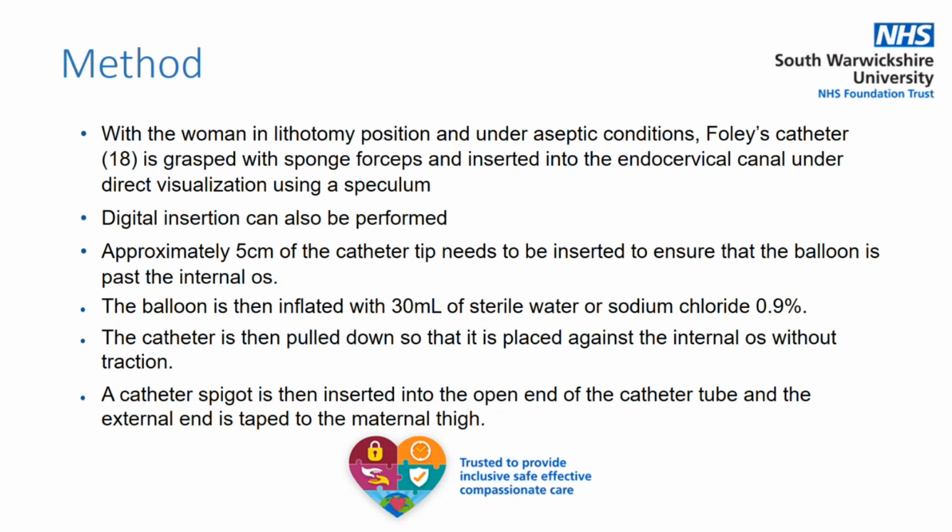So moving on now to talk about the methods for insertion of the Foley's. I'll briefly talk through this with this slide, and then there'll be a short video clip which hopefully will show you that it's an easy technique, and I hope that you'll be able to feel confident inserting it.